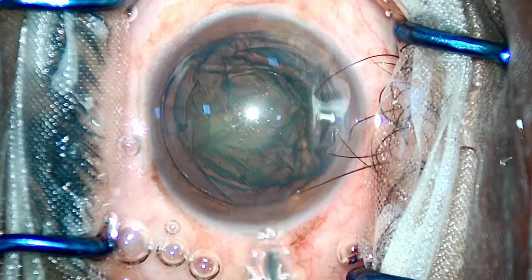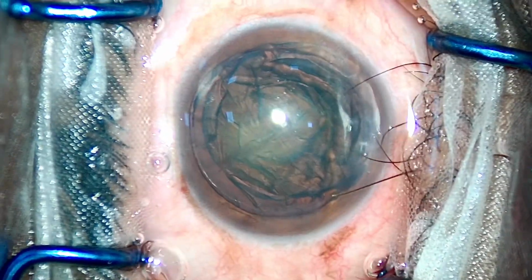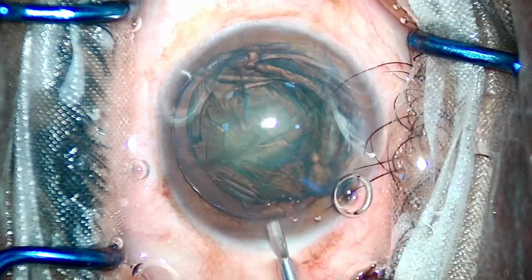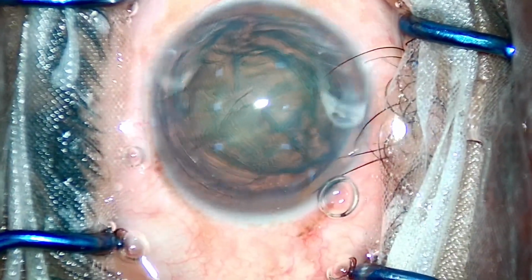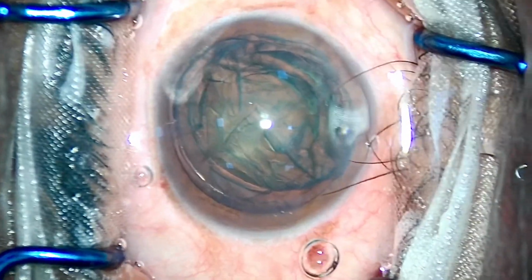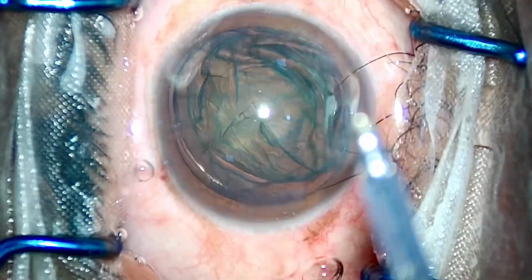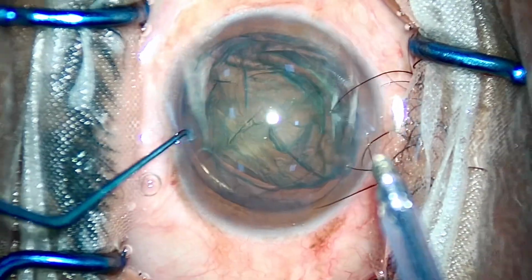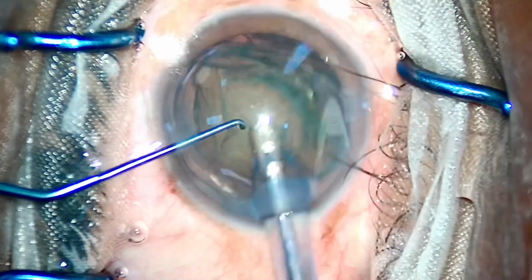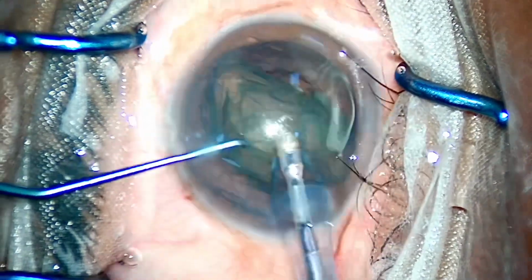So, after thousands of cases, I had noticed a pattern: why is it that some patients get no astigmatism and some patients get mild degrees of astigmatism? When I asked my professor about this, he said one should strive to make the incision in the shape of a T, a perfect T. The horizontal line of the T should be the line that connects the two side ports, and the vertical line of the T should be the direction of the main port.